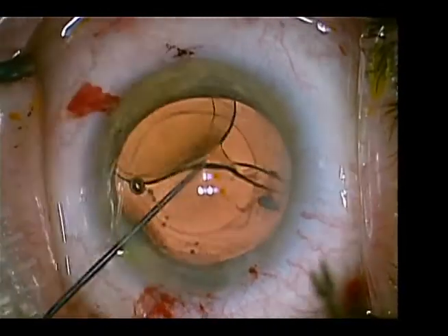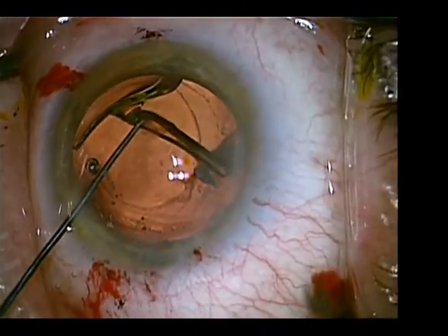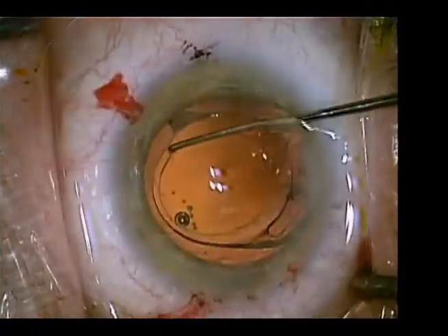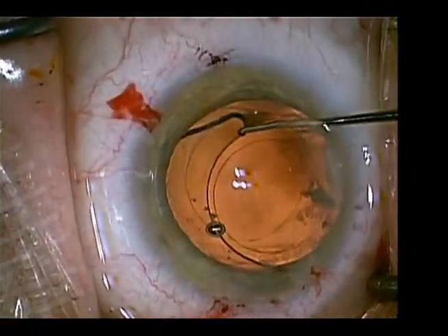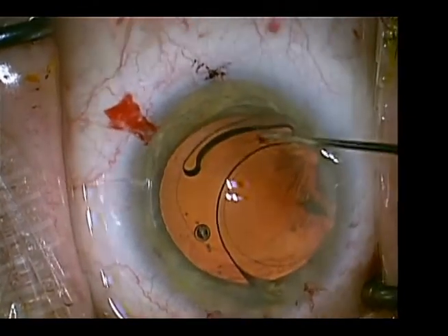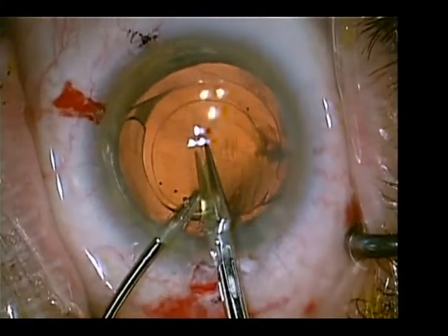As one can note, the attachments to the capsule bag are rather tenacious, but with careful and gentle blunt dissection and visco dissection, eventually the loop is freed from the capsule fornix. Interestingly, the superior loop shows very little in the way of adhesion to the capsule.